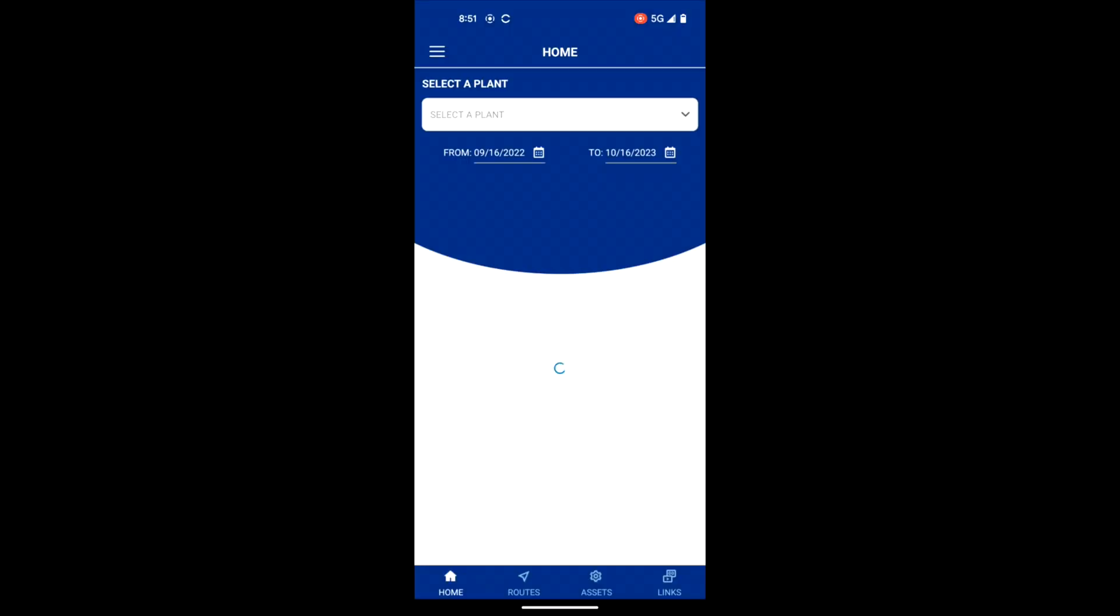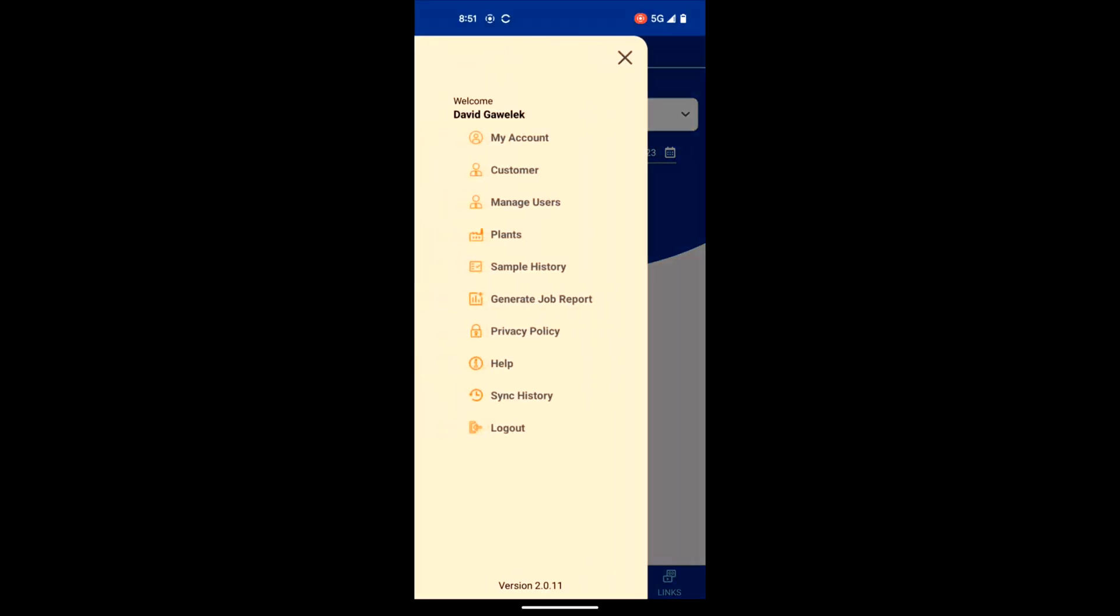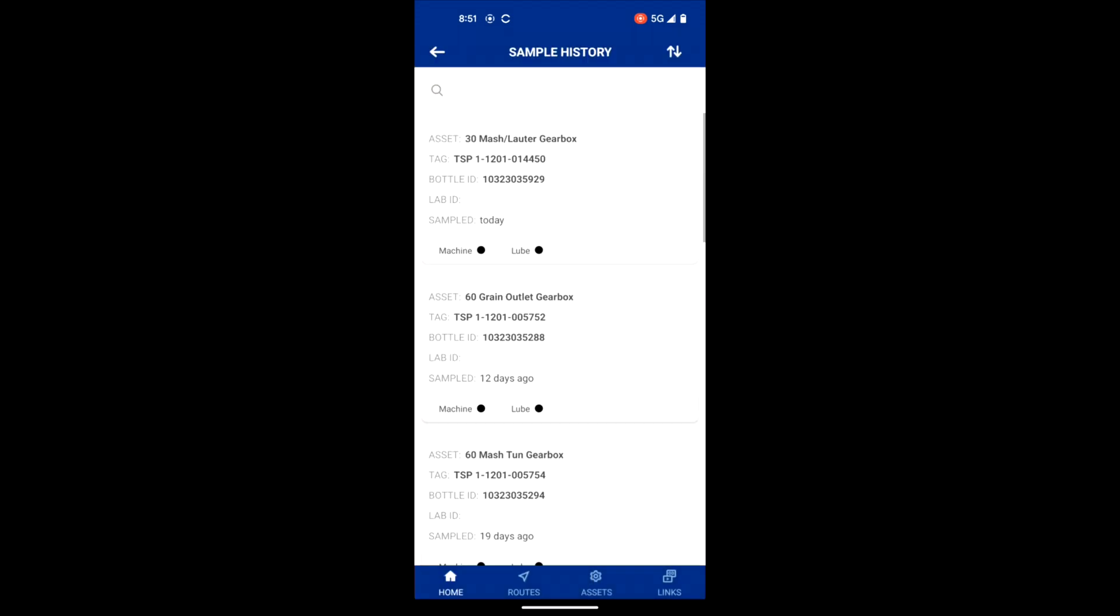Verify the sample was linked by selecting the menu icon on the top left, then sample history. The sample you linked should be present here.